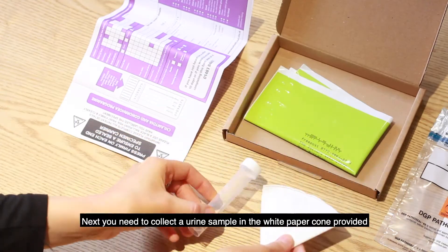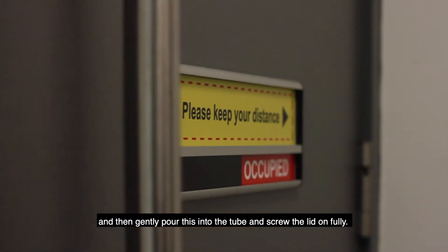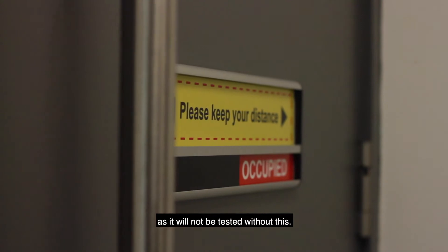Next, you need to collect a urine sample in the white paper cone provided and then gently pour this into the tube and screw the lid on fully. Make sure your label is on the tube as it will not be tested without this.